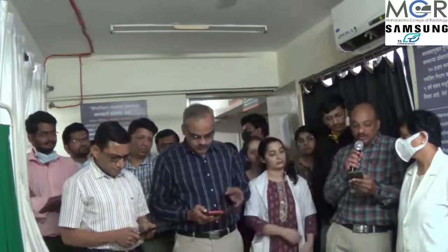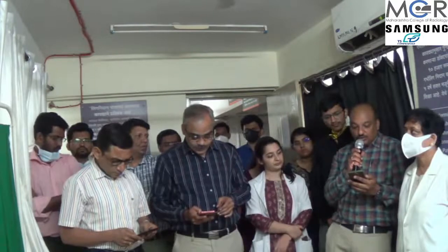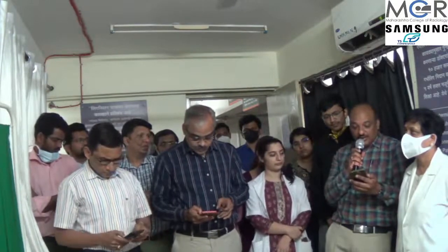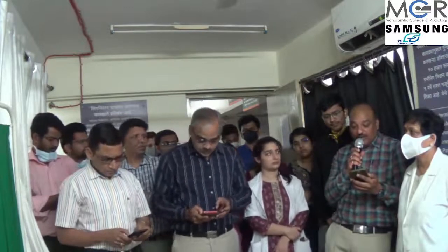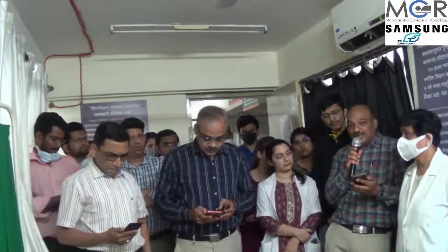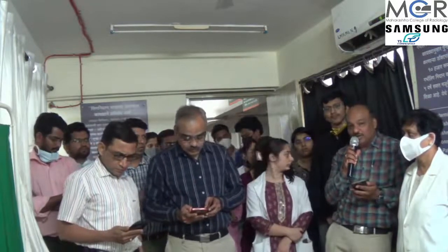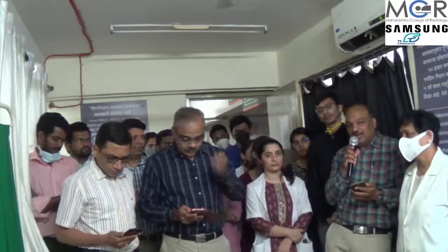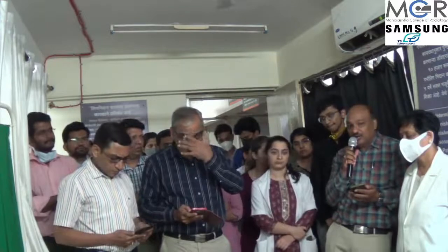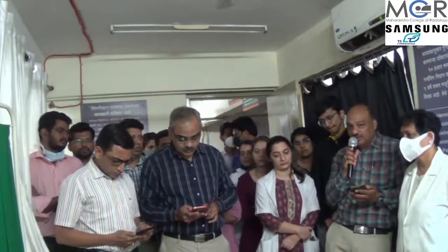One question was for ovulation studies, the referring doctor asked to do only per abdomen ultrasound in our center. Is per abdominal follicular monitoring an apt way to report, or should we deny and always ask for TVS? As I said in my presentation, follicular monitoring is always by TVS, and transabdominal examination is obsolete now. So always recommend and ask this referring doctor to go for TVS only.